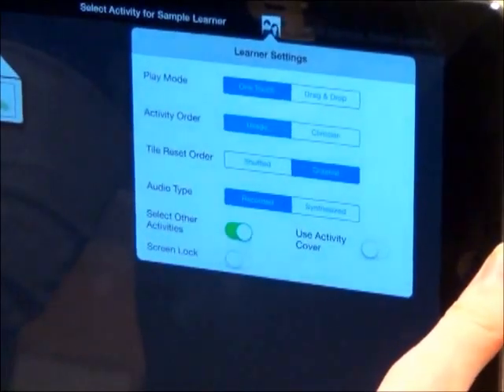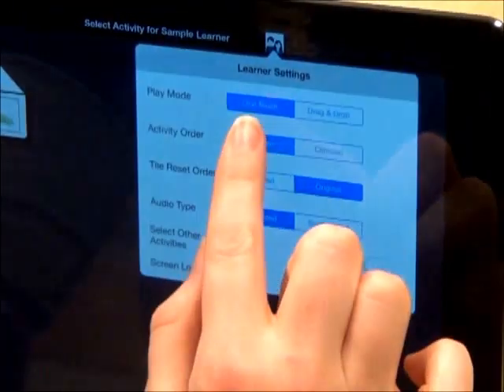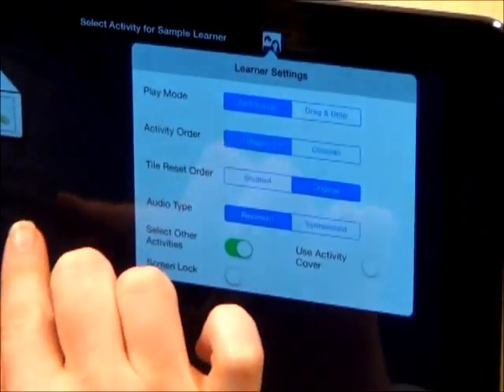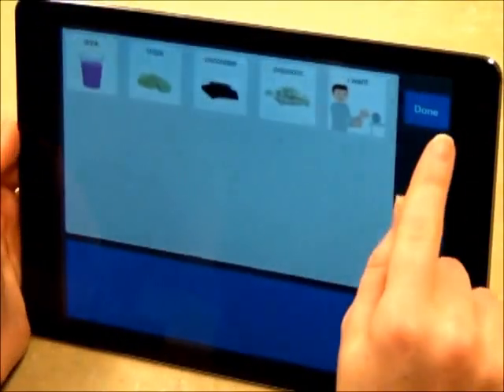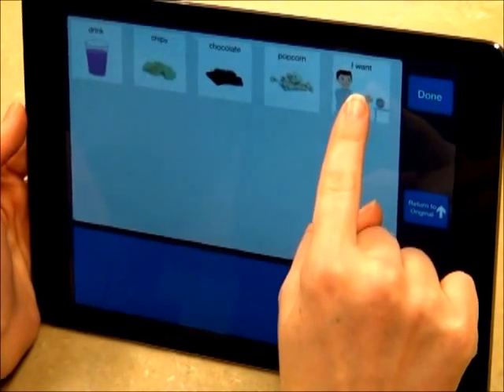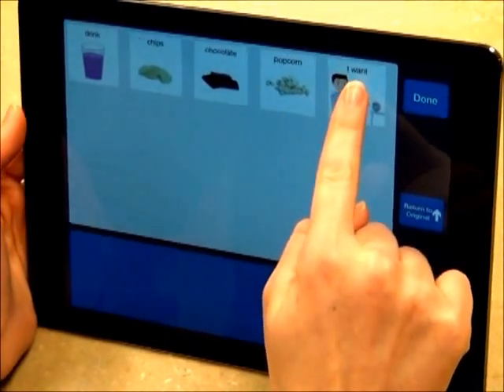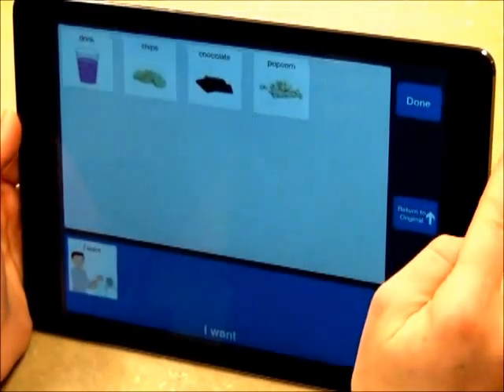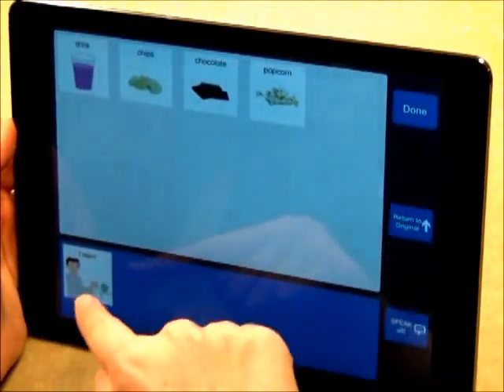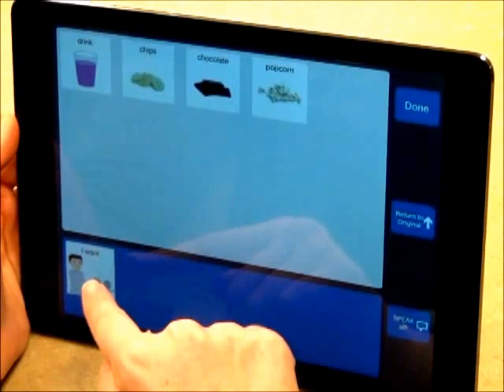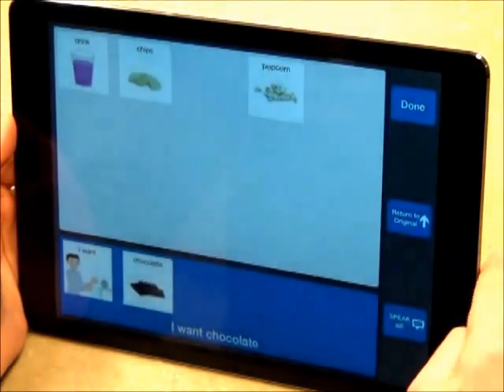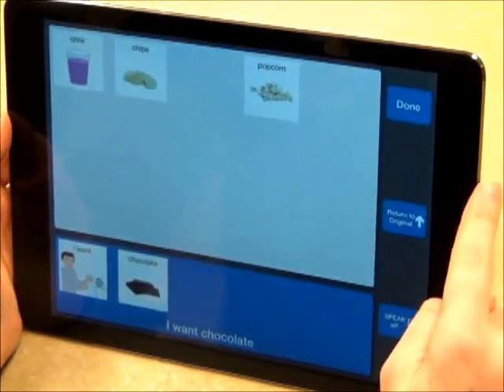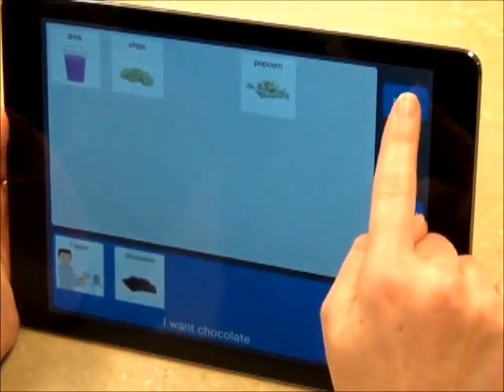You can either use one touch or drag and drop. For learners with fine motor control difficulties, one touch may be a better option. When we enter this activity, we see that we can tap one symbol — I want — and it will automatically be moved down to the sentence strip. Chocolate. When you're finished, press Done.